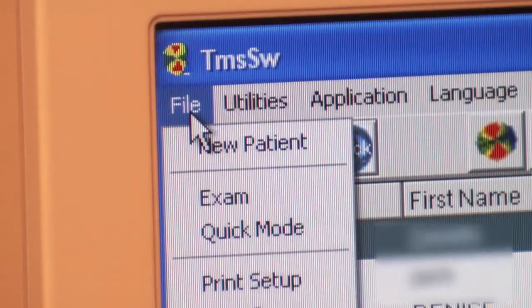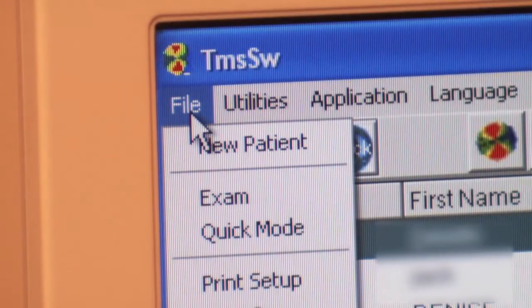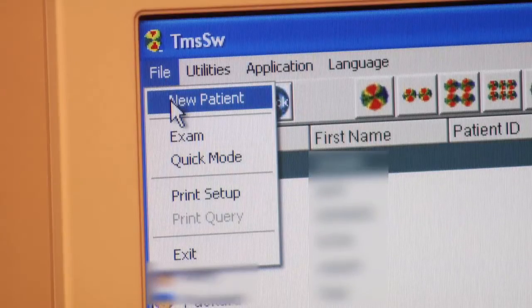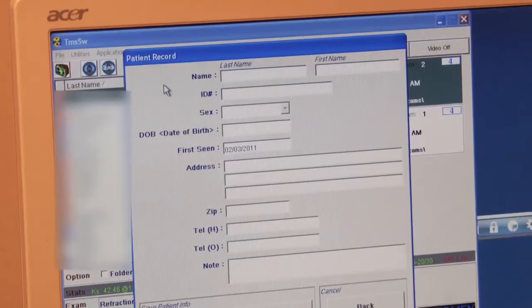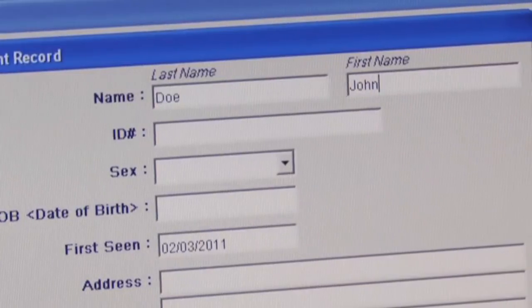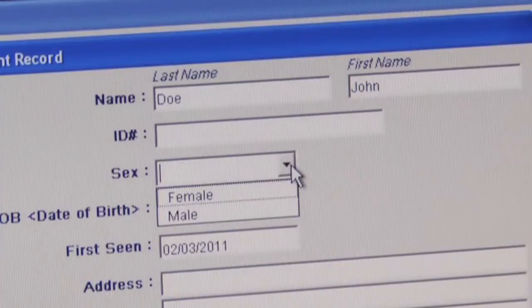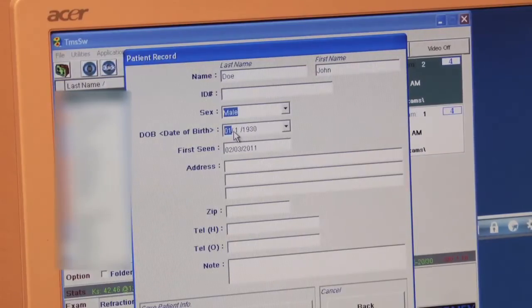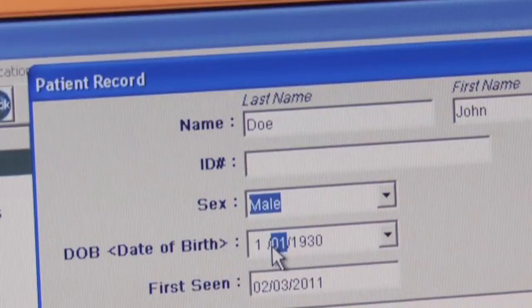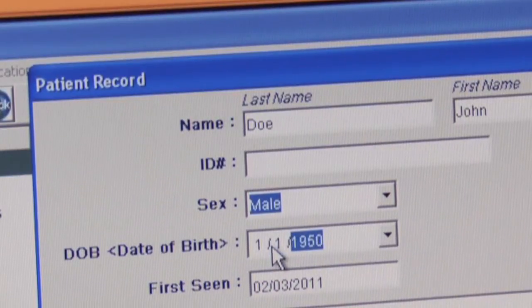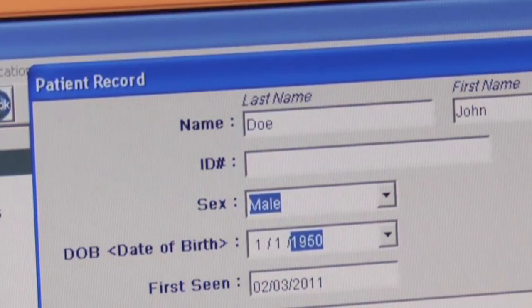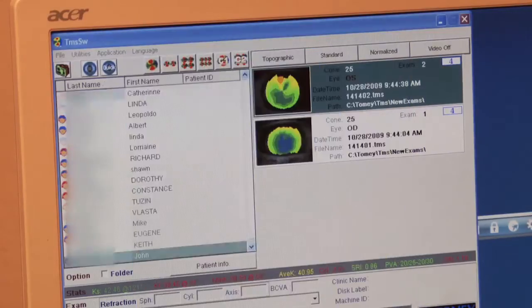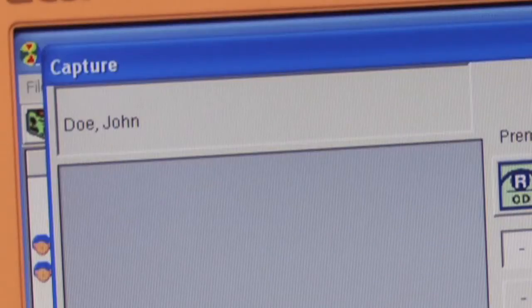Left-click File in the upper left-hand corner and select New Patient. Type in the required information pertaining to that patient. After you have typed in the required information, you can either select Do Exam or Save and Next. The patient record window will allow you to enter as many patients as you wish, or you can enter one patient at a time. After you have made your selection, the capture screen will appear.